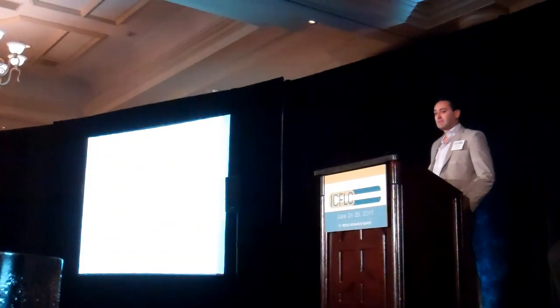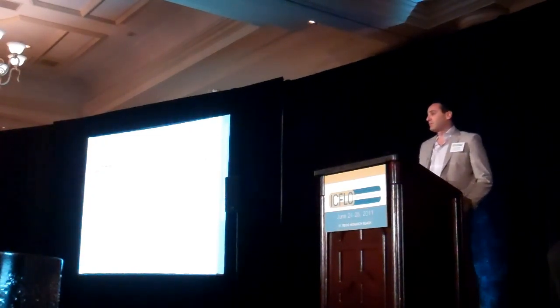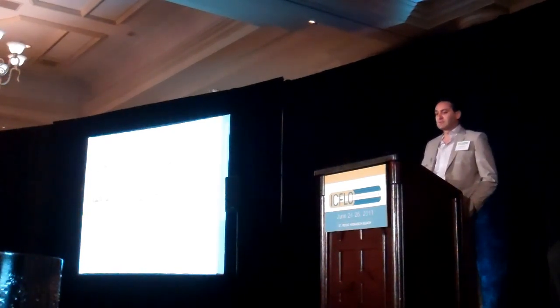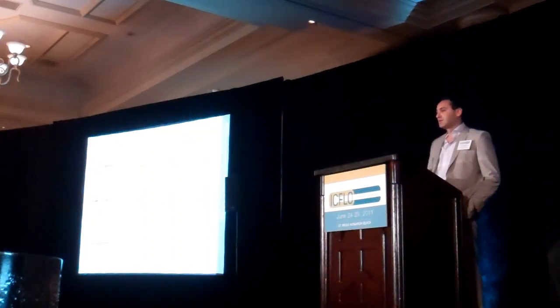When we look at each of these, we have several considerations. With the toric lens, there are gradations in the power that we insert. Additionally, we're addressing a corneal problem in the lenticular plane. With a blade, LRI, or AKs, we have skip lesions, the potential to perforate through the cornea, and lack of precision when we create these incisions. And then the femto laser gives us the ability of no skip lesions and increased precision.